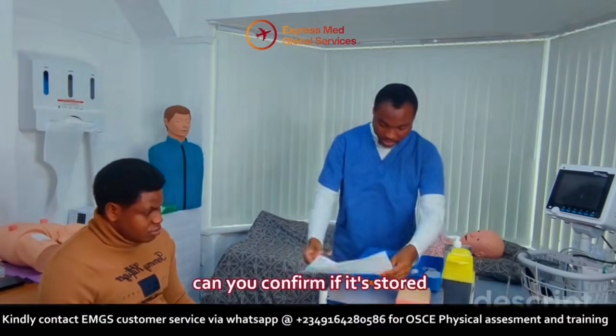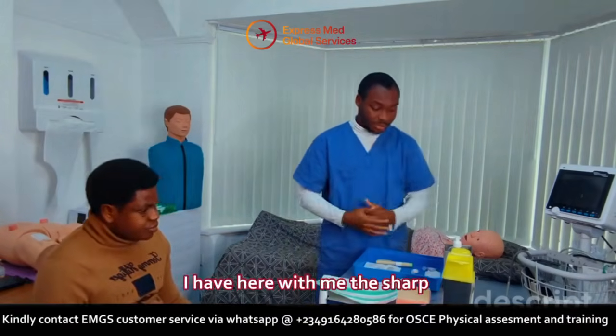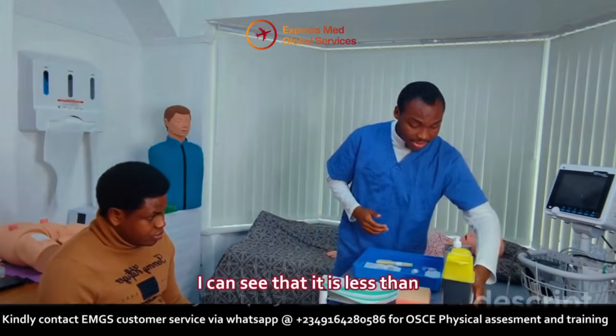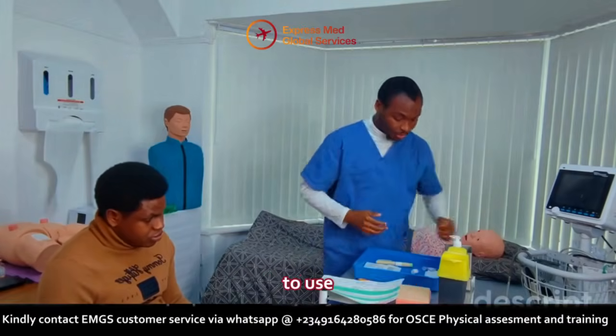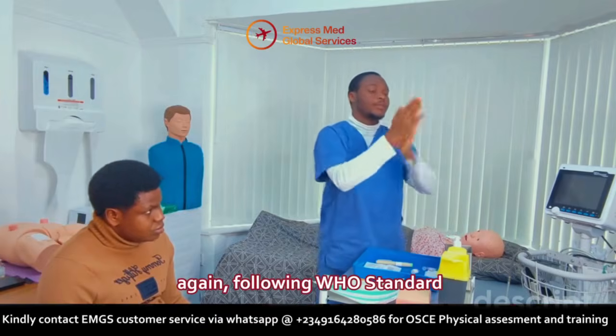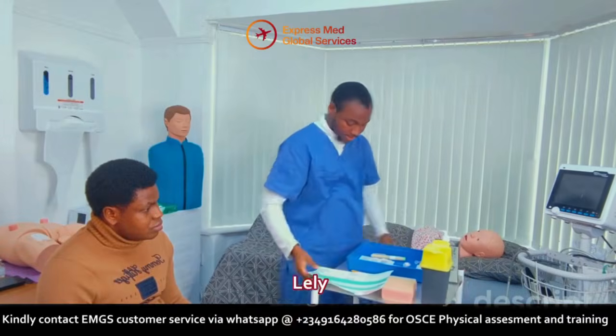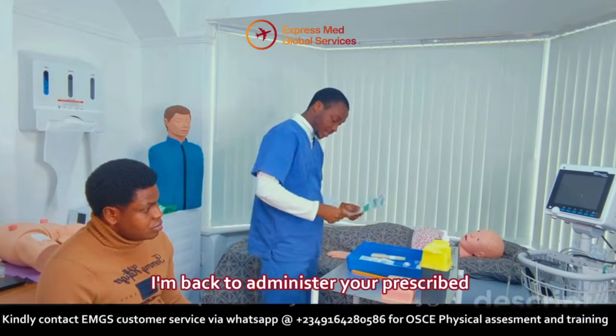Examiner, can you confirm if it's stored at room temperature? Yes. Alright, I'm happy to proceed. I have here with me the sharps box. I can see that it is less than one third filled and I'm happy to use. I'm going to perform my hygiene again, following the WHO standard. Alright, lady, I'm back to administer a prescribed insulin injection.